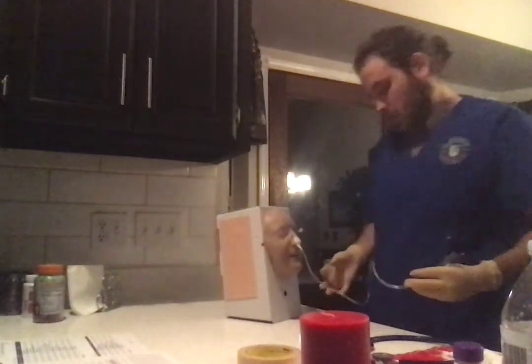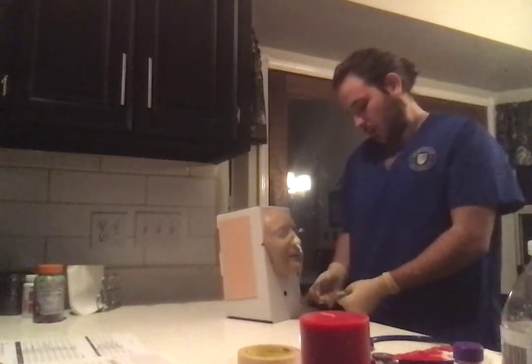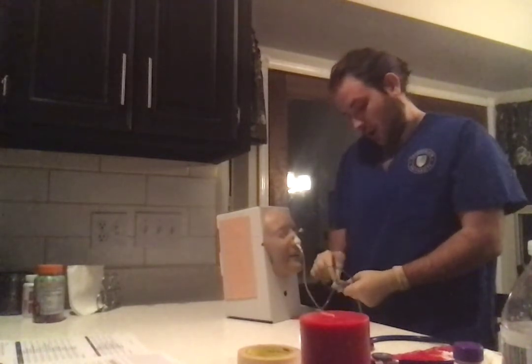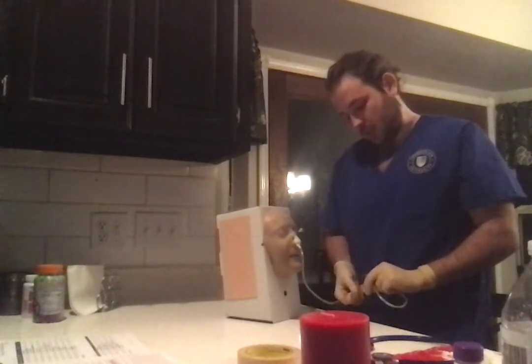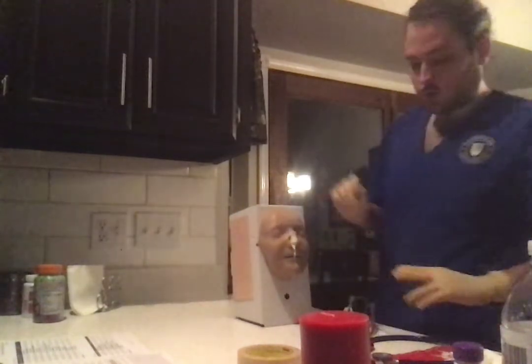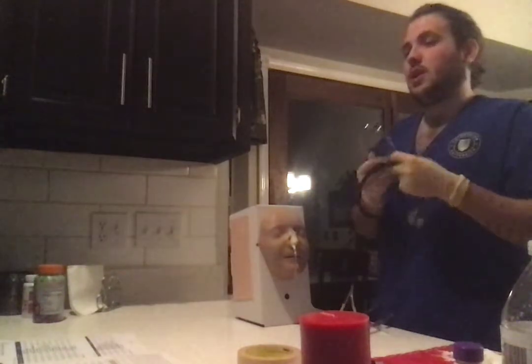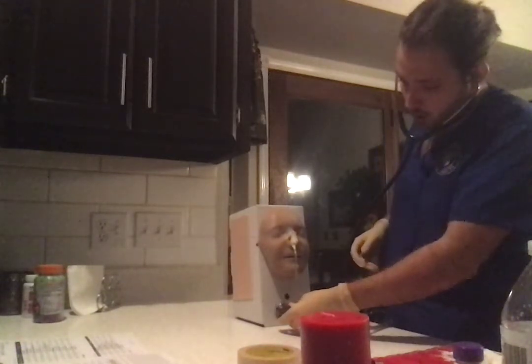And then a little bit lower than the shoulder, right around where the measurement ends, we would create our anchor so we can bobby pin or safety pin this to the patient's gown. We would auscultate Mr. Laerdal's lung sounds again to be sure that we did not enter the trachea into the lungs, and confirm.